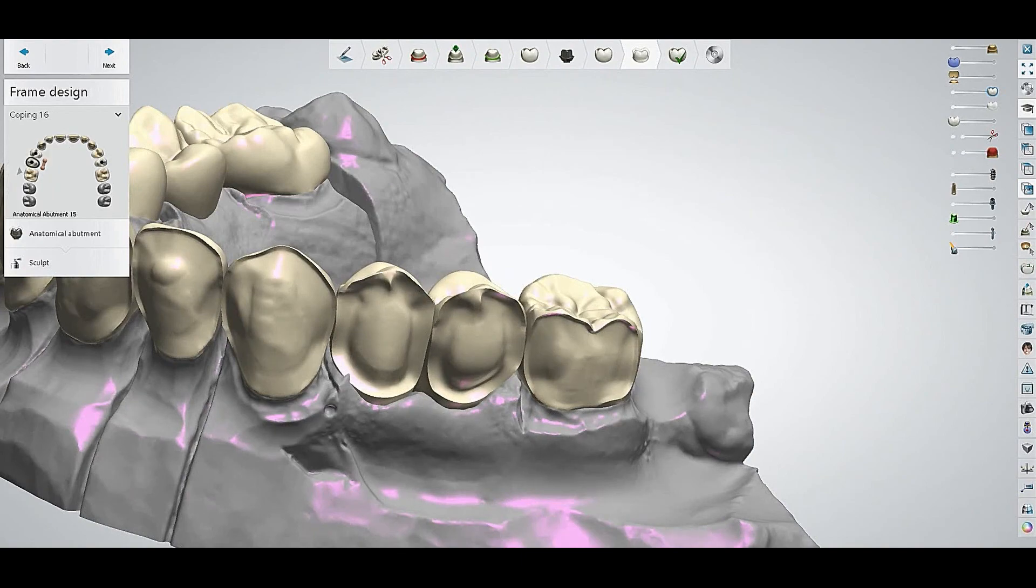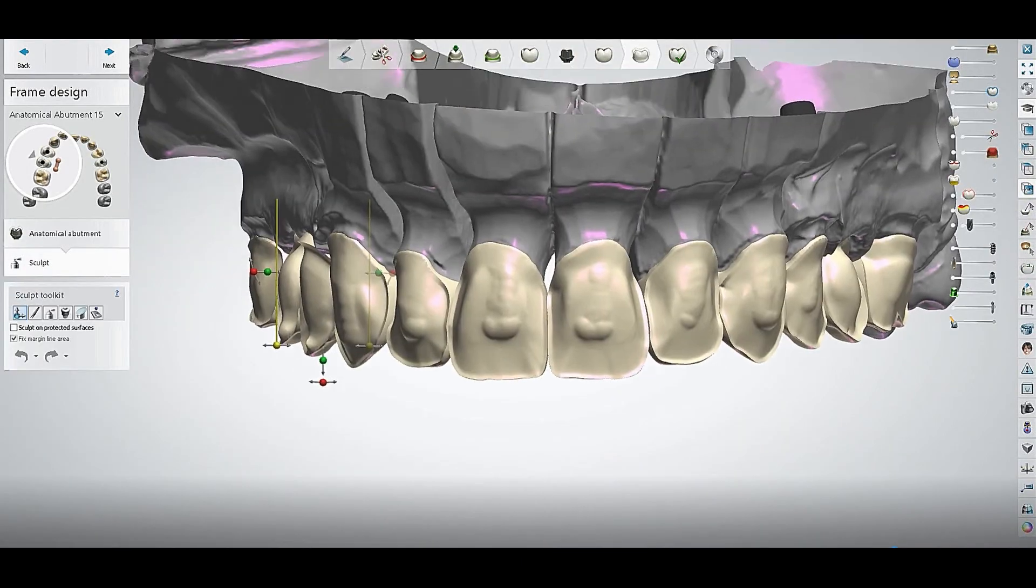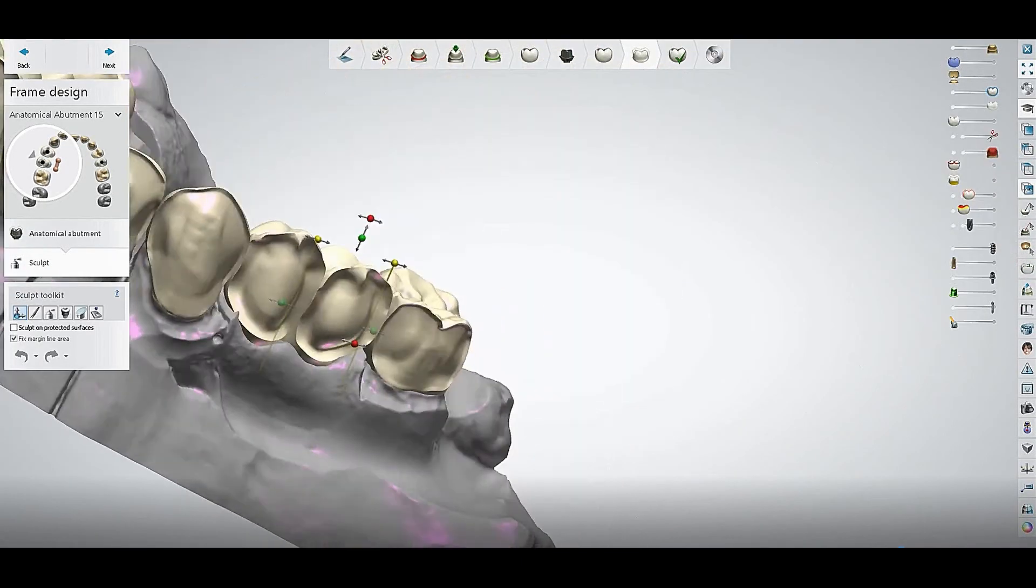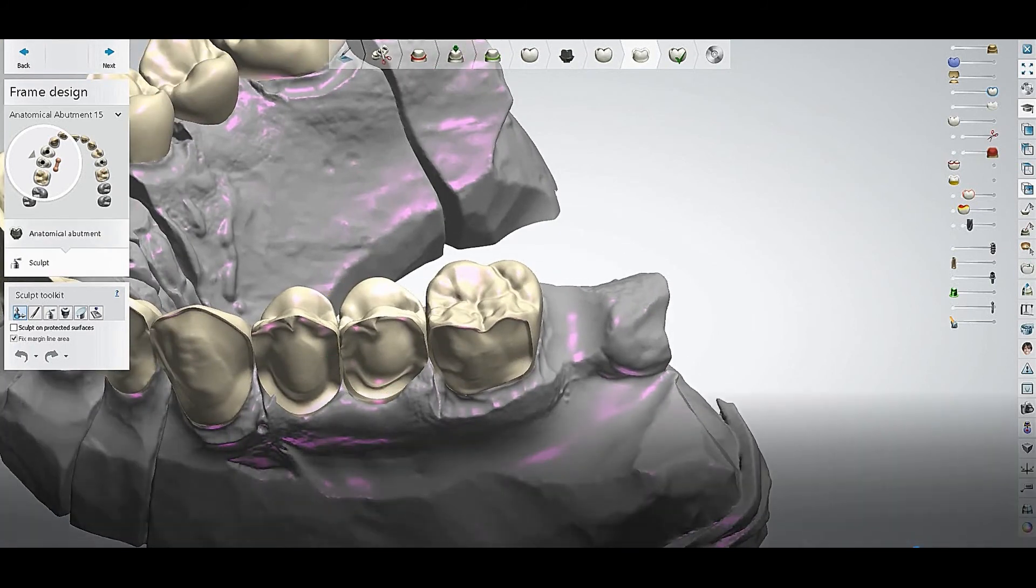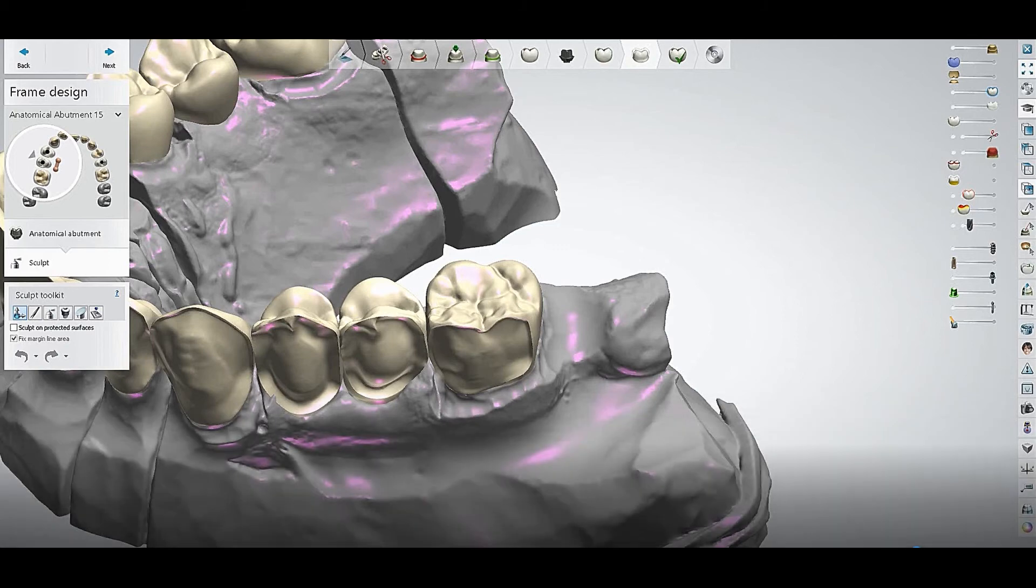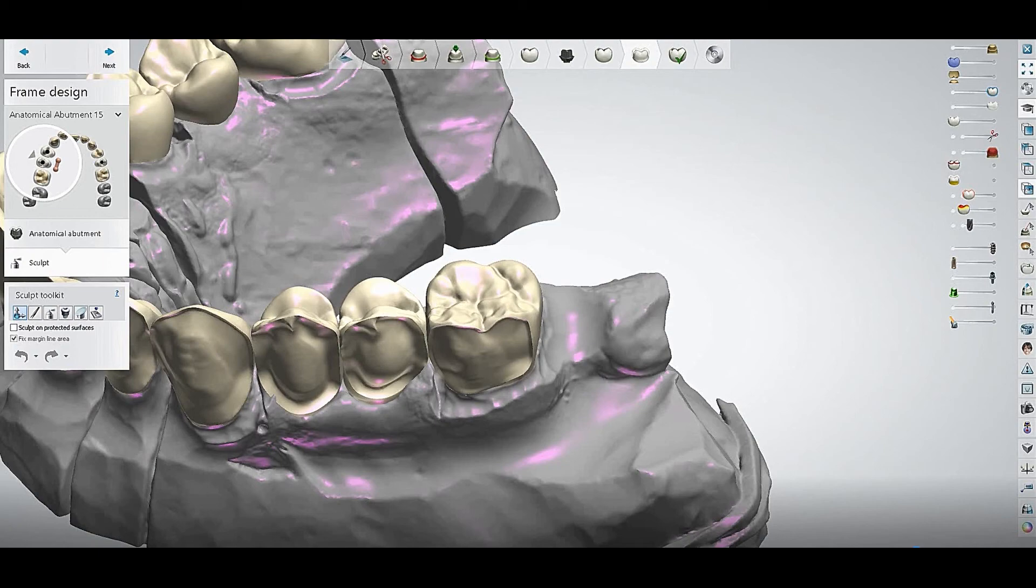So this was the easiest way to solve this problem when you have this error. You have to go back to the implants and just make the emergence profile slightly bigger. That's it.